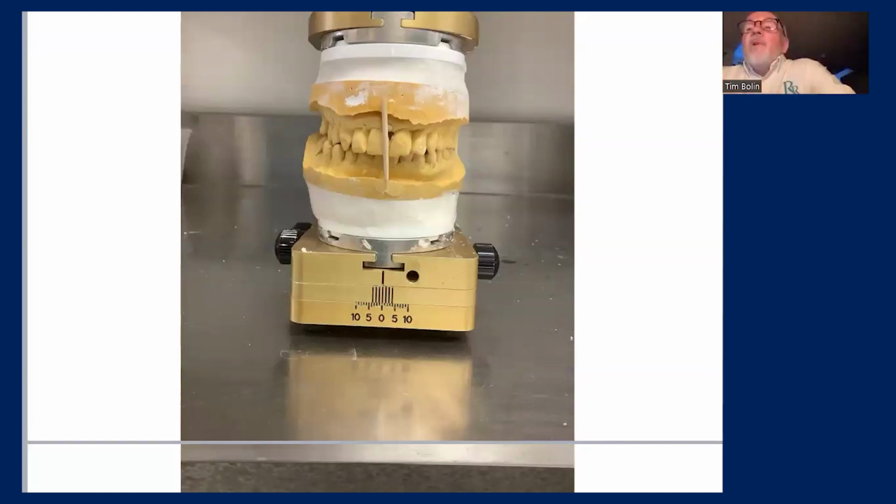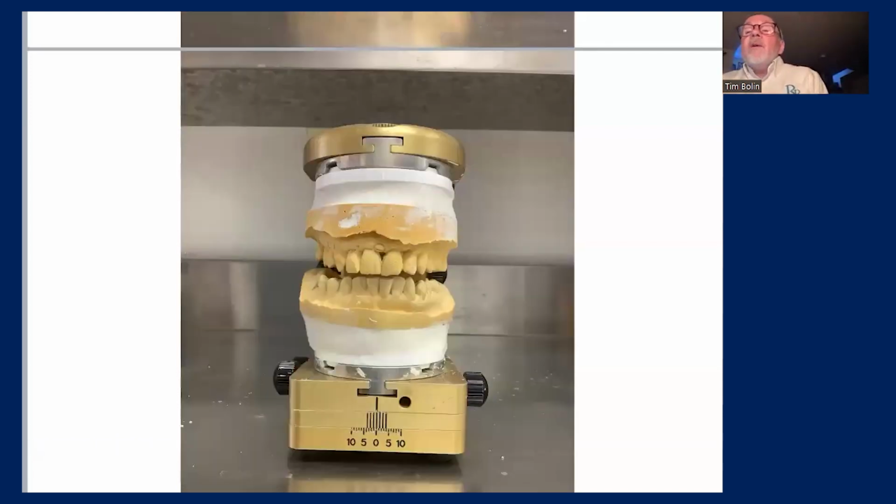He's got about a 5 millimeter deep overbite, so we've got to open that up. There we are at 5 millimeters. Now, all I did here was raise the vertical column of the Acculiner 5 millimeters. That's the distance that I'm going to need to get a flat plane in the anterior for this case. Now, you notice the posterior opening there.